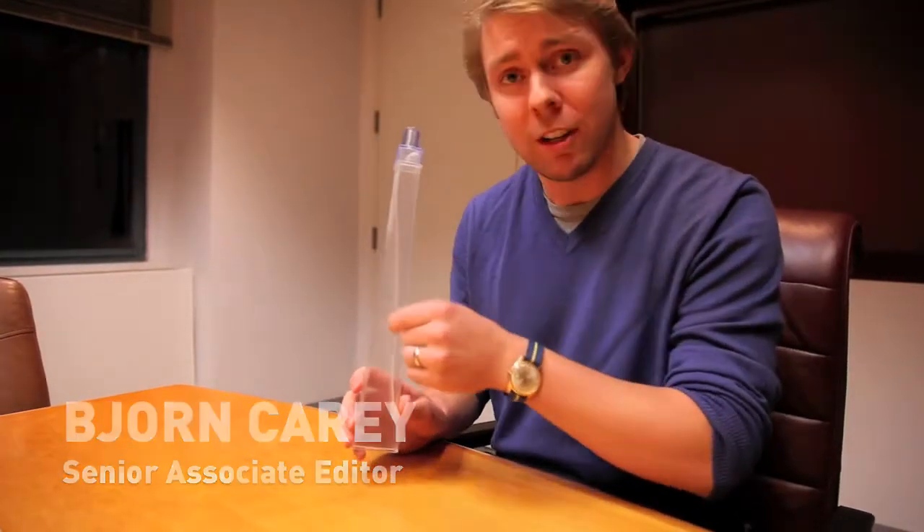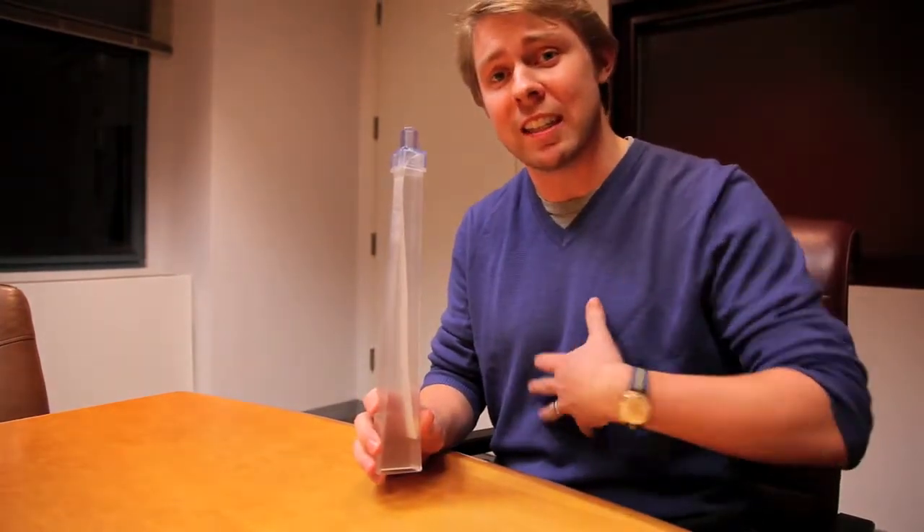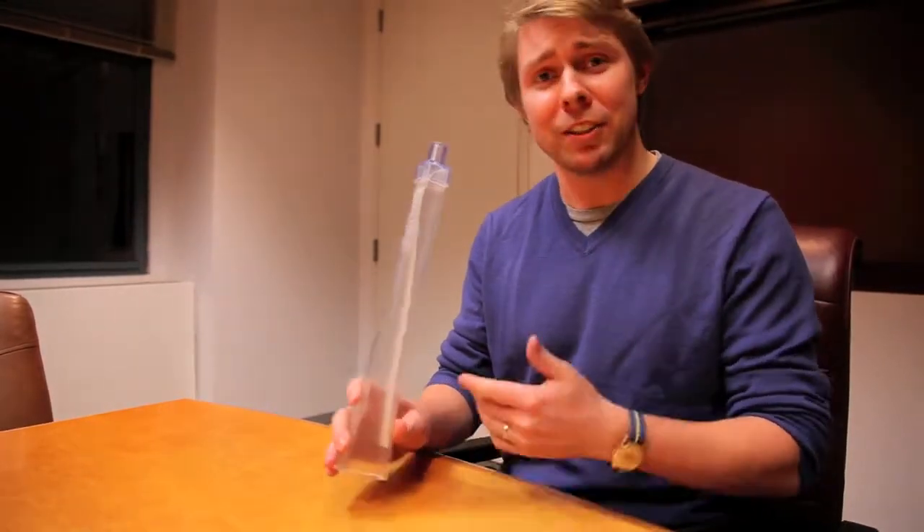This is the lung flute. If you blow into it a few times, this little reed inside flaps back and forth, and that sends vibrations into your chest that dislodge all the built-up mucus so you can cough it up real easily. I'm going to show you how to use it right now.